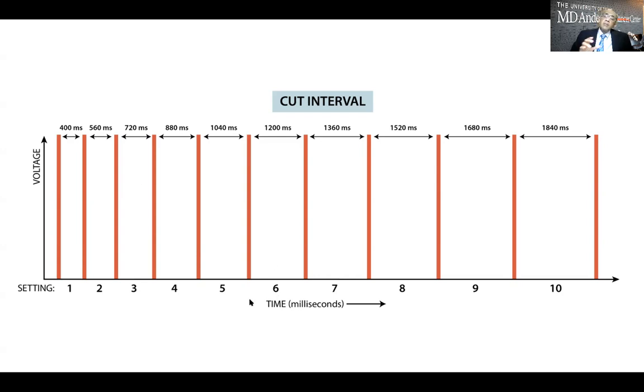So something to keep in mind if you want to adjust this. But I don't adjust my settings. I just put 313 for most of the lesions, except when the lesions are very juicy and have a lot of vessels. In that case, I may increase the interval to a longer interval for a lot more coagulation in between those cuts.